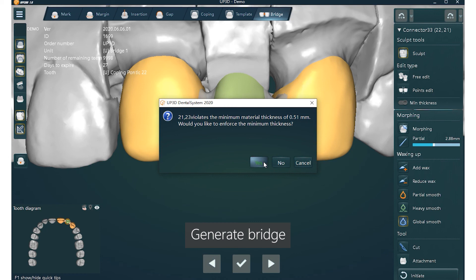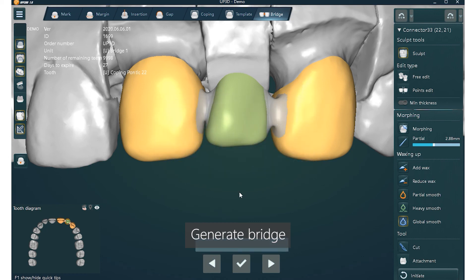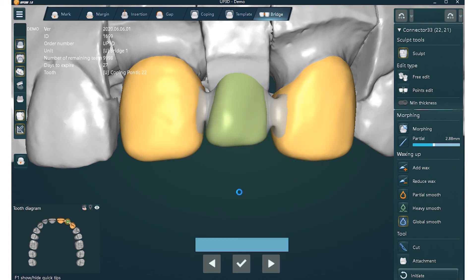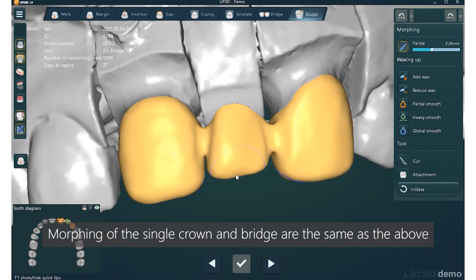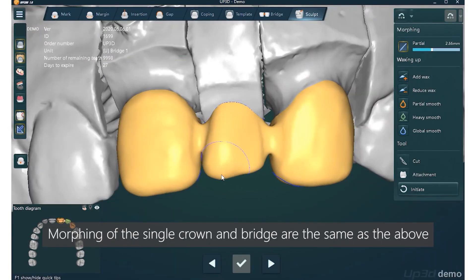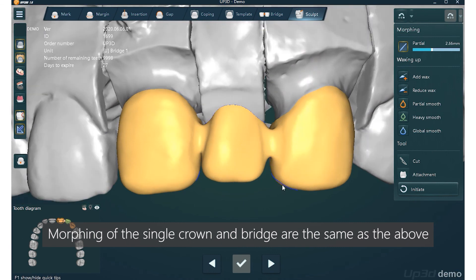Generate Bridge: click the Next button to generate the bridge after the connector is generated. You can still continue to do morphing after the single crown and the bridge are fused. For morphing operations, please refer to the design steps of the bridge.